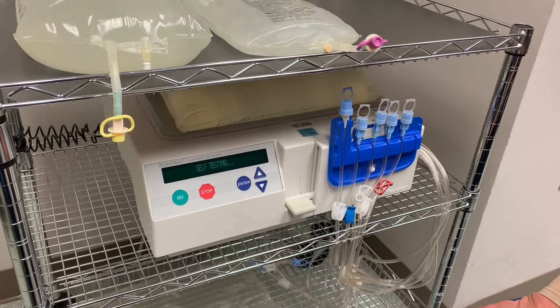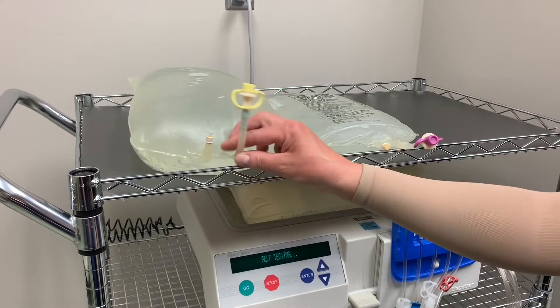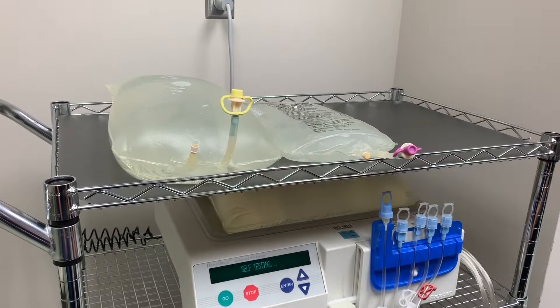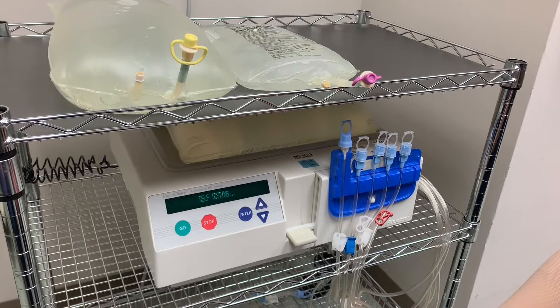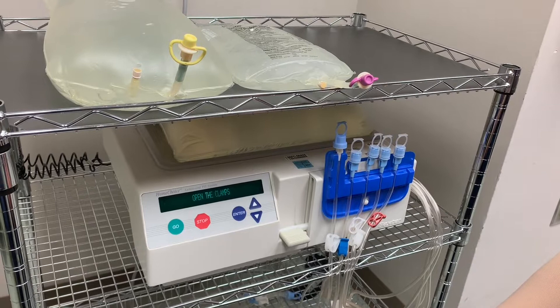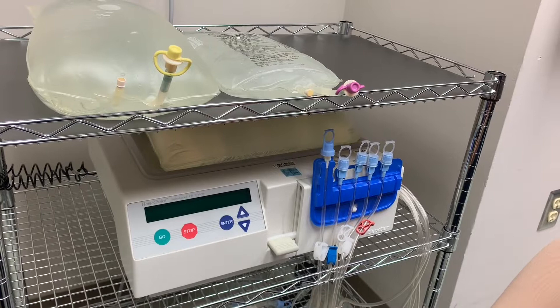Everything is sterile, so if anything is broken or not intact, throw it away and get new supplies. These little blue things are called frangibles — this one is not broken, and the pull ring is on there. In real life, when the patient is at home, the cycler should be about the same height as the person lying in bed — within 12 inches higher or lower. If it's higher it will drain slower; if it's lower it will drain faster, which could increase drain pain.